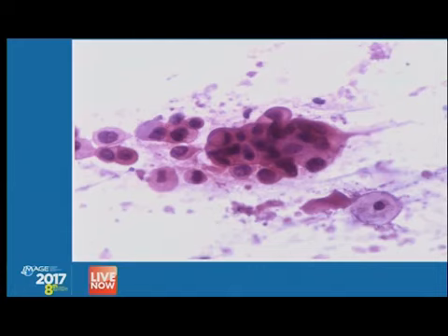And we are waiting also for the histological specimen. Of course, it needs more time and probably will be ready for today, but we have already the diagnosis on this material, so we are very happy with what we took from the biopsy.